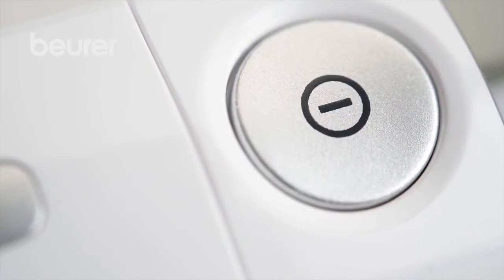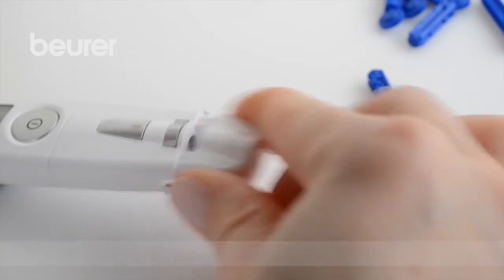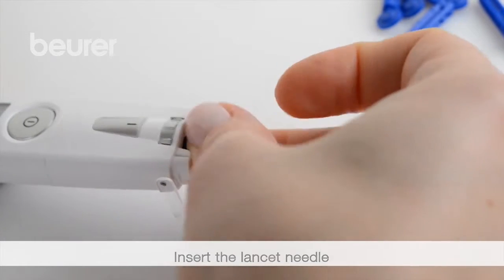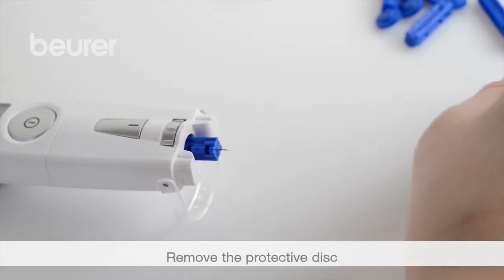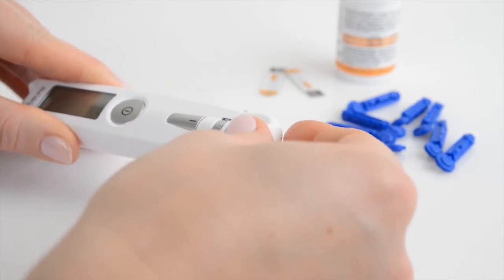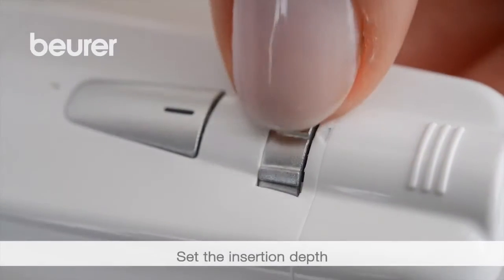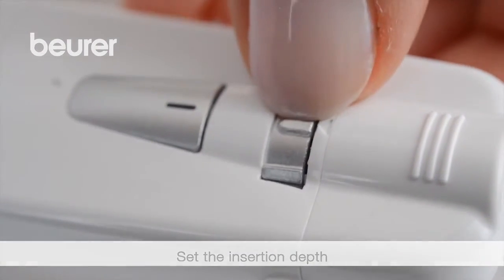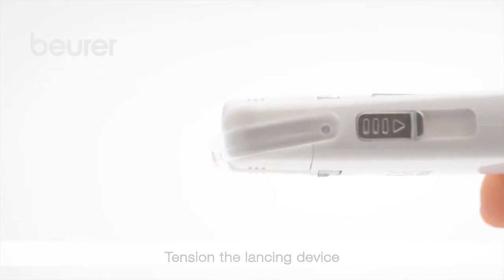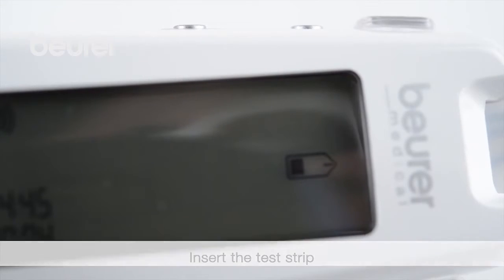For the measurement, remove the cap from the lancing device. Place the lancet needle into the lancing device and secure it. Remove the protective disc from the lancet. To take a blood sample from your fingertips, position the cap on the lancing device. Set the insertion depth by turning the small dial, then tighten the lancing device. Insert a test strip into the device with the contacts first.